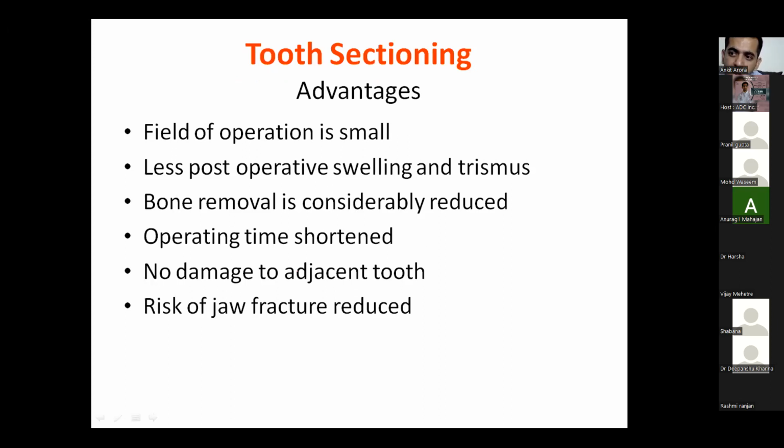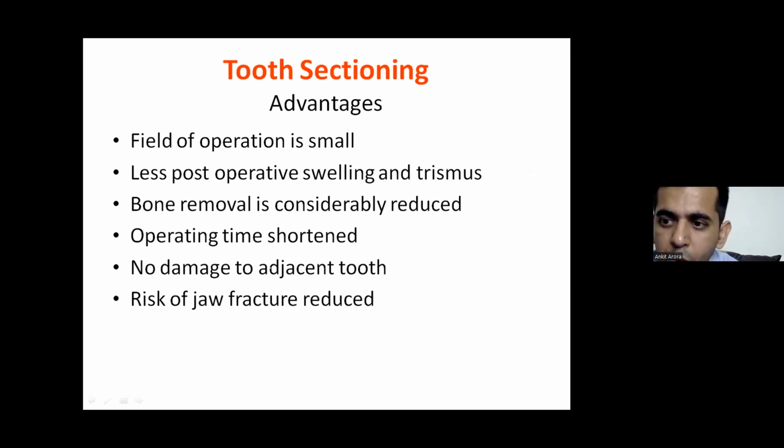Obviously, it has some advantages. The field of operation is small. You need not go for removal of the bone and go ahead. There would be less post-operative swelling and trismus, and bone removal is considerably reduced. Basically, you need not go for more removal of the bone.